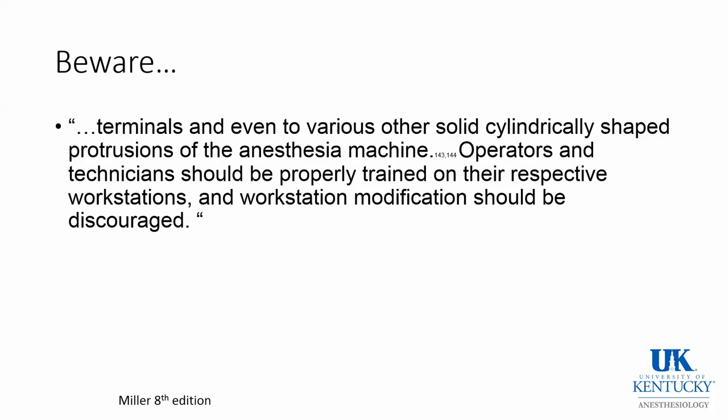Therefore, everyone who uses a particular anesthesia machine should know exactly how it's used and what its safety features are.